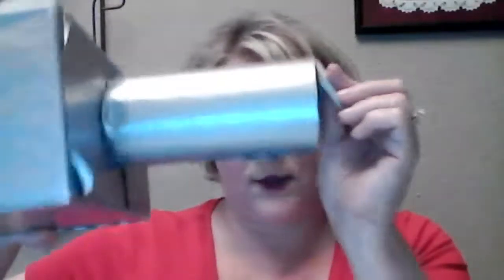So do y'all notice on your film, get your film, there's a white side to the film, and there's a blue and white side, or a turquoise blue and white side? The white side of the film will always, always face your PID. So when you put it in the mouth, the white side of the film will touch the teeth and it will face the PID, your positioning indicator device. So the white side of the film will always face your PID.